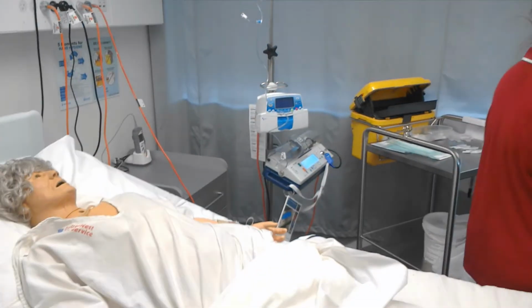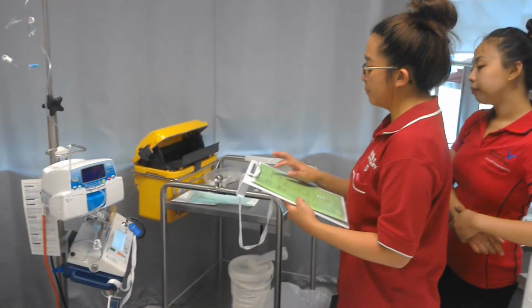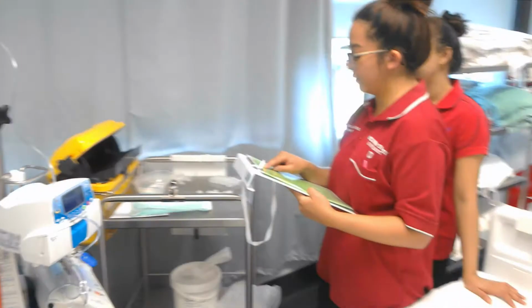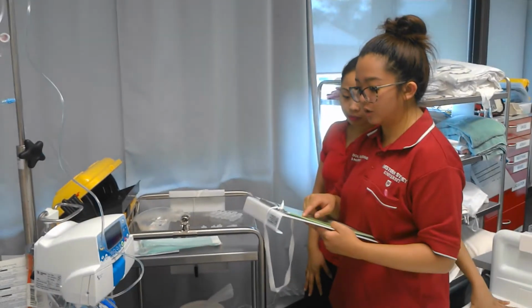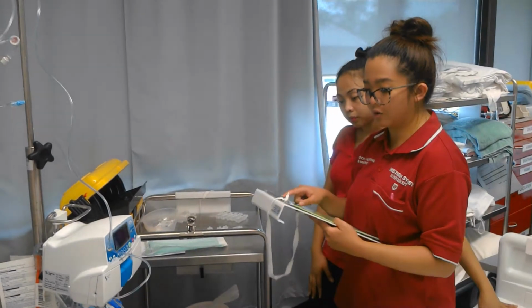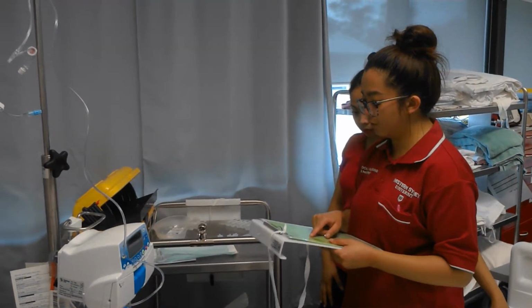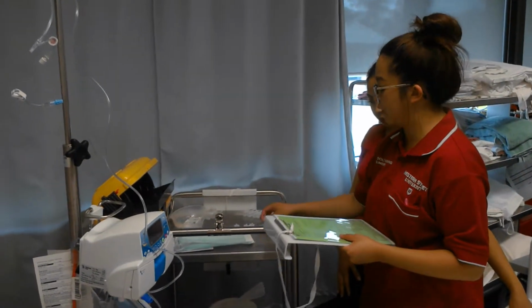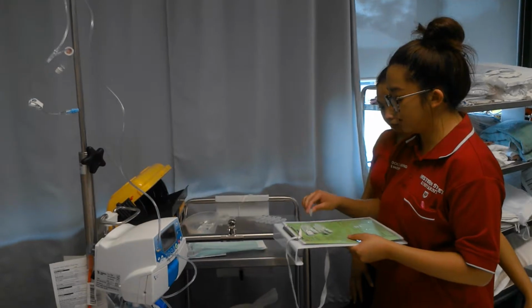Second nurse, can you do the final drug check with me? So I've got patient Miriam Added, date of birth 7th of the 1st, 1969. MRN's 174963. She's got no known allergies, and I know this information is correct when I did the patient check with her. The medication for today is morphine, 50 milligrams in 50 mils, and I know that I needed to get 5 mils of morphine, and I've got 5 mils of morphine here.